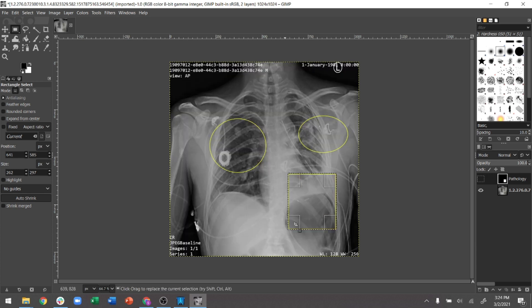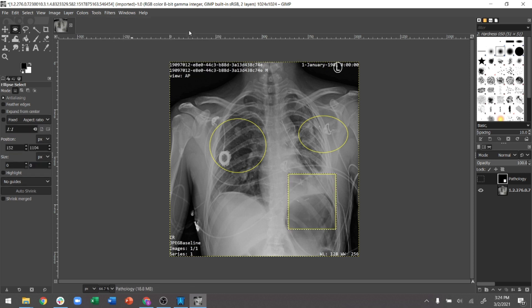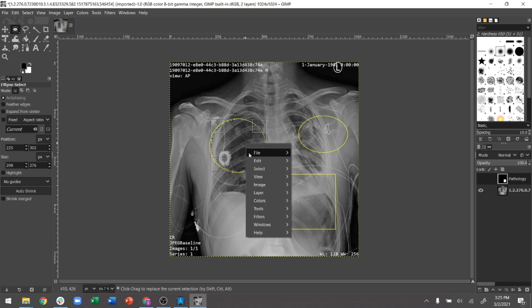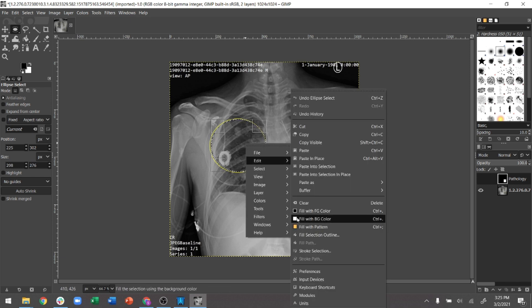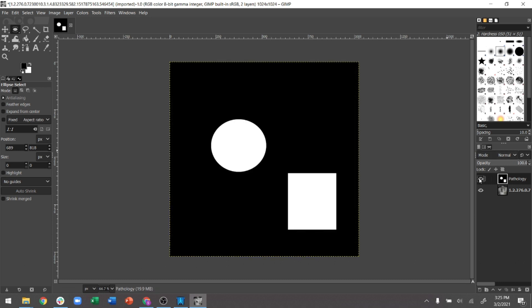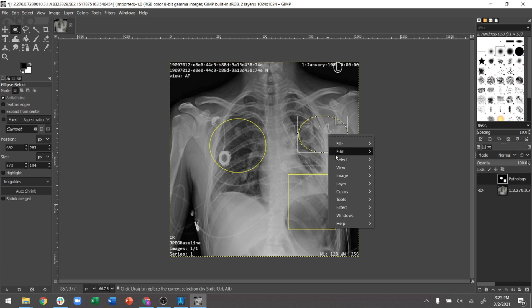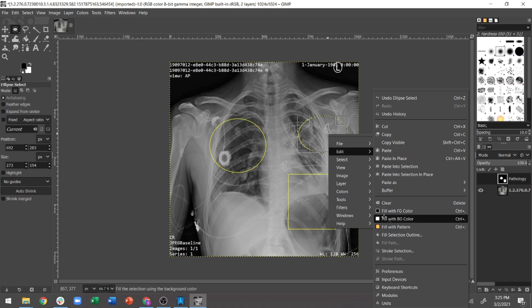Next I switch to the elliptical selection tool because the remaining regions are elliptical in nature. I select the region, go to Edit, and fill with white color. To verify it was done correctly, you can view one layer on top of the other. I repeat this for each additional region of interest, selecting and filling with white each time.